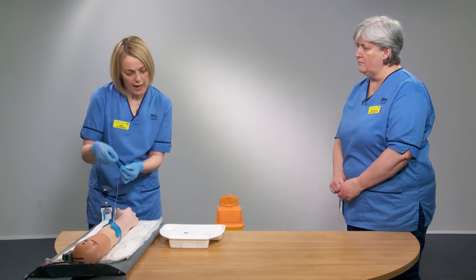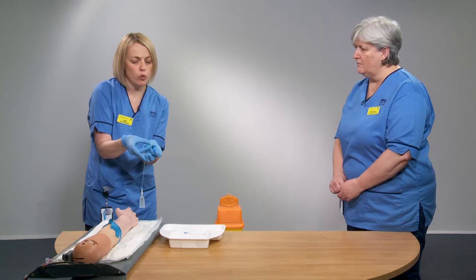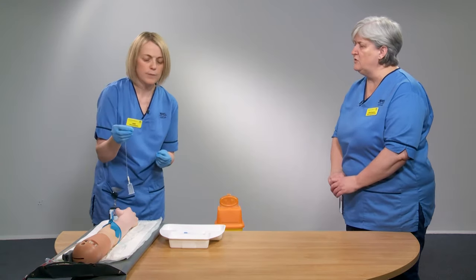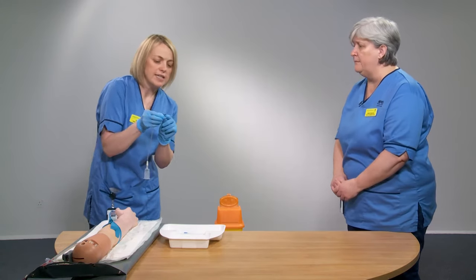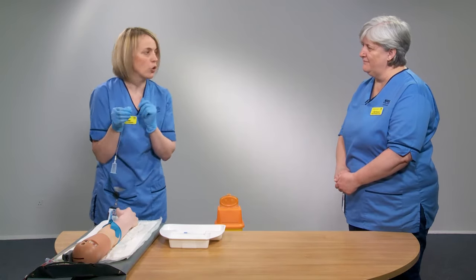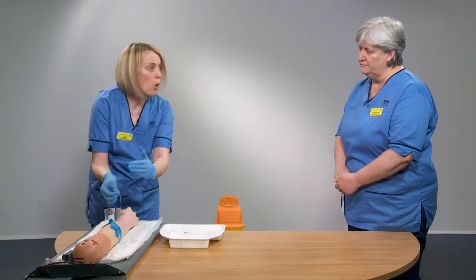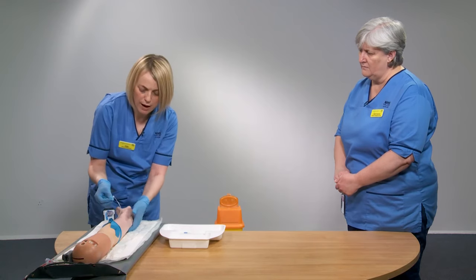To hold the butterfly needle, bend up the wings. There is a bumpy side — hold the wings together and unsheathe the needle so it points in the right direction. The beveled end of the needle — the open, angled tip — should always be pointing to the ceiling before you enter the vessel. Hold the needle so your hand is well away from it to avoid contamination. Use your dominant hand to insert.